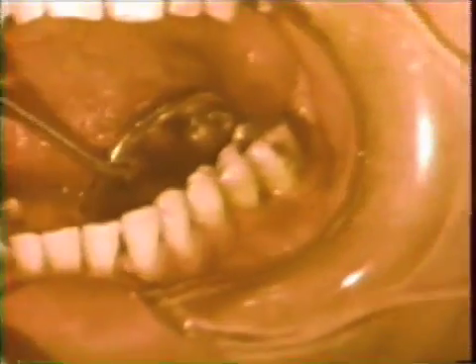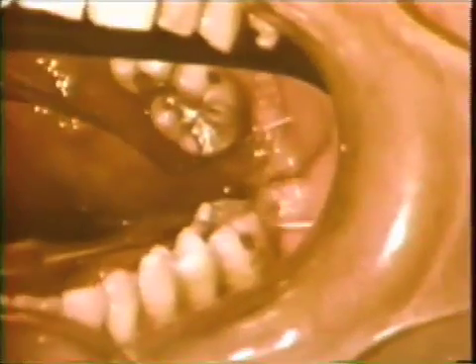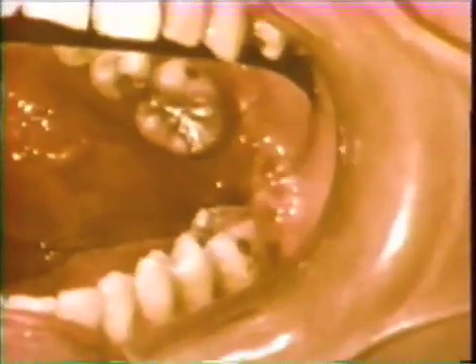Two months post-operatively, the tissues appear to be healing well. A shallow sulcus can be demonstrated by the probe which is inserted around the molar. Note that the tissue distal to the molar is flat buccal-lingually. Although the tooth structure is sound below the margin of this amalgam, a new restoration will be inserted.